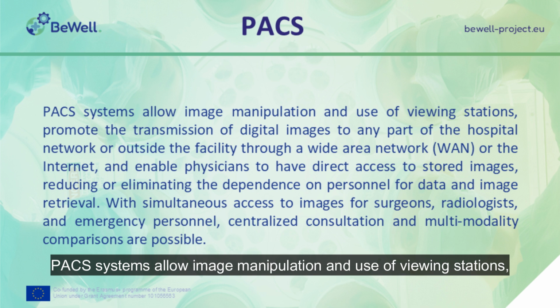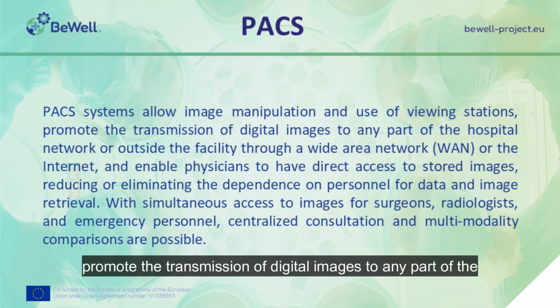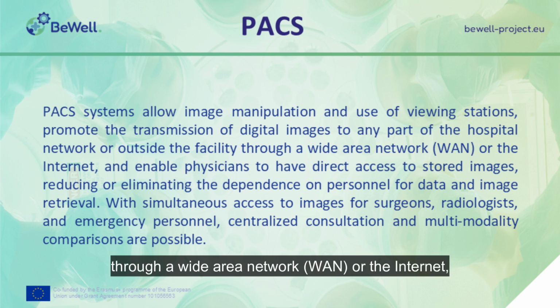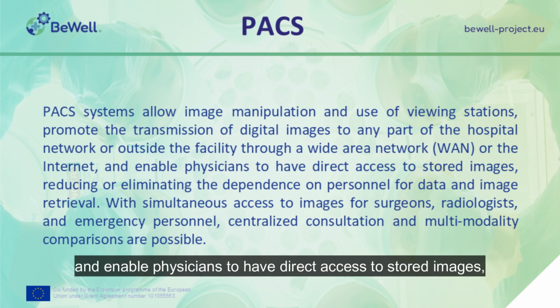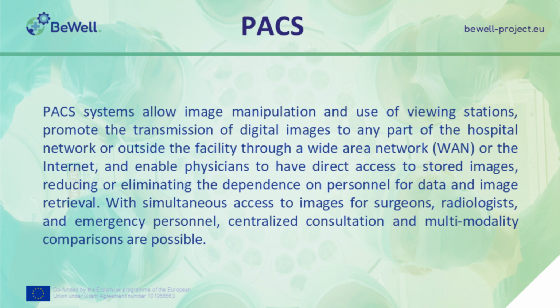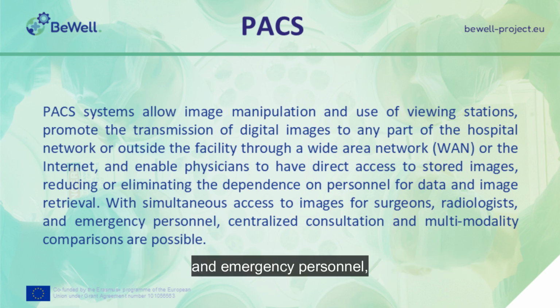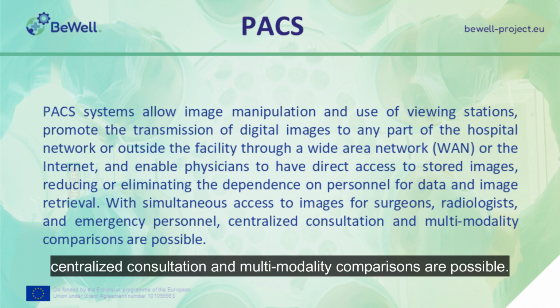PACS systems allow image manipulation and use of viewing stations, promote the transmission of digital images to any part of the hospital network or outside the facility through a wide area network or the internet, and enable physicians to have direct access to stored images, reducing or eliminating the dependence on personnel for data and image retrieval. With simultaneous access to images for surgeons, radiologists, and emergency personnel, centralized consultation and multimodality comparisons are possible.